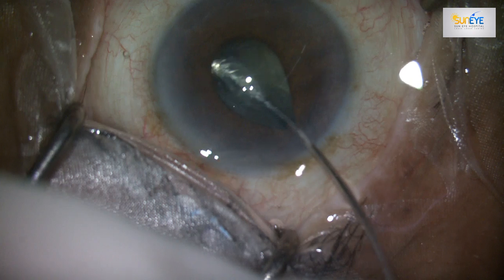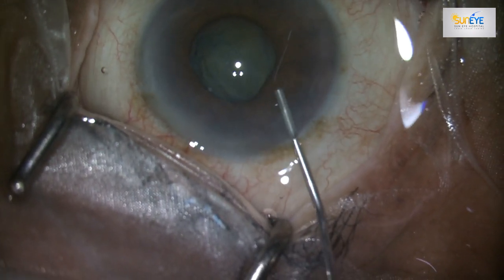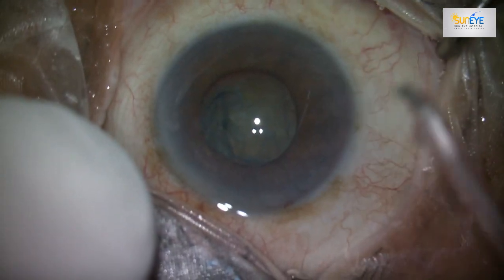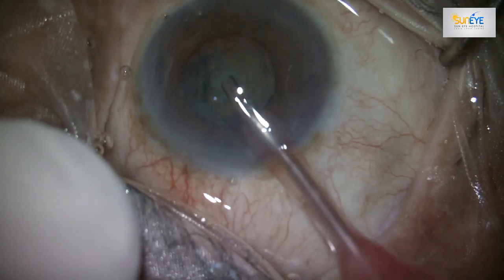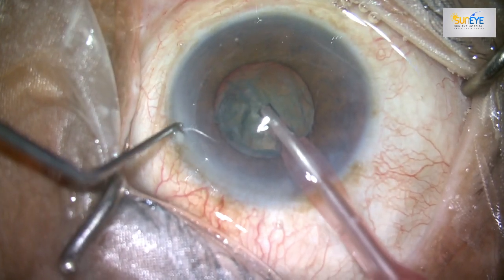in such cases is the hold and split method, keeping the tip stationary while using the second instrument to bring pieces closer, hold them firmly and split them sufficiently and efficiently. Throughout the procedure, maintain patience and precision to avoid complications.